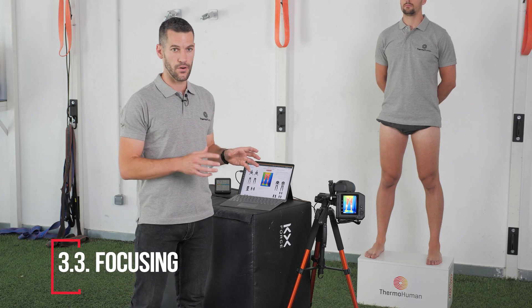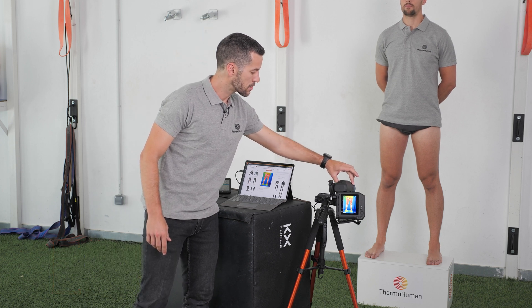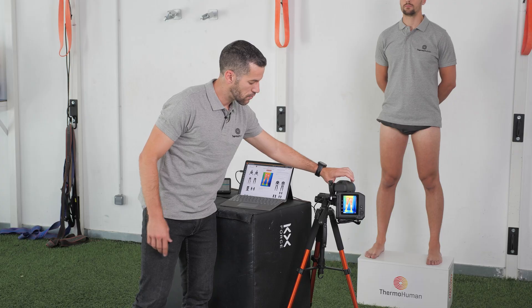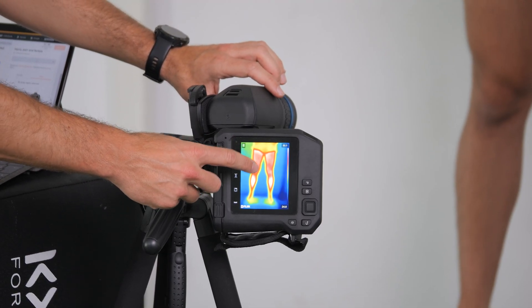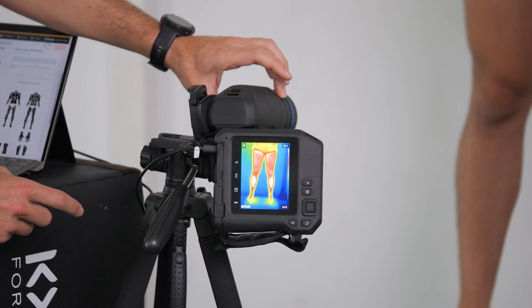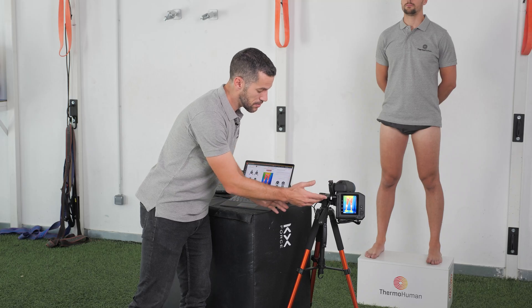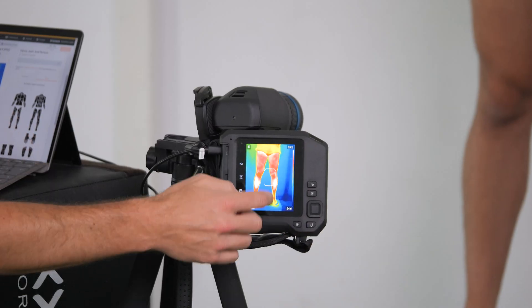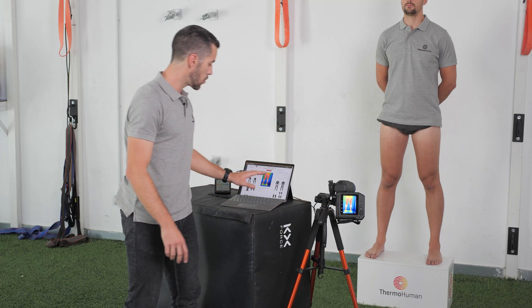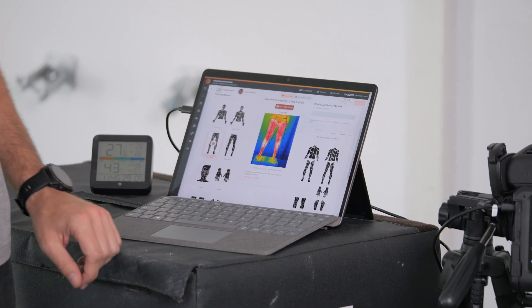The third point is about focusing. If your camera has a manual focus, remember that you should manipulate this part of the lens to achieve perfect focus. As a tip, if you have a yellow line in the boundaries, try to reduce it until the image is focused. If your camera has automatic focus, just press the button and you will see a white box appear. And if you are using the plug-and-play system, you can directly focus from the software.